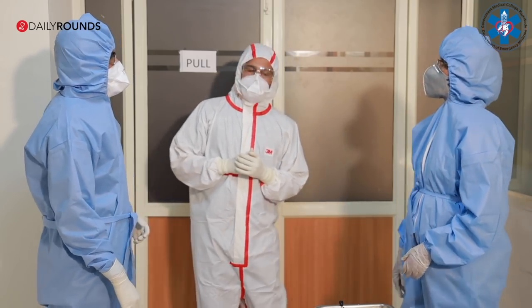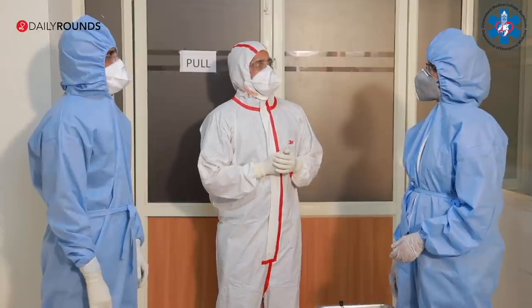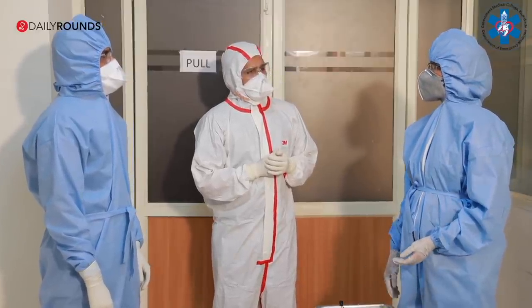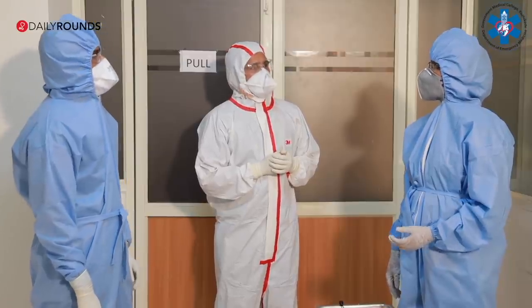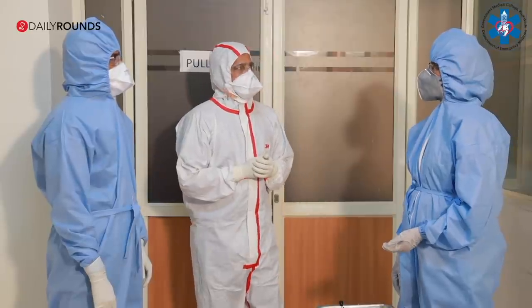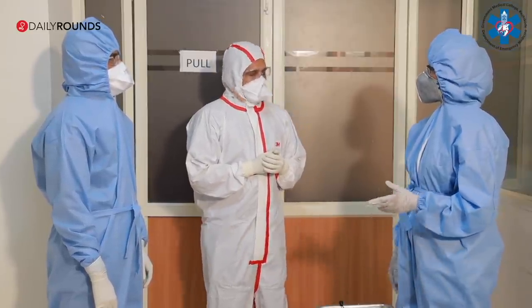Okay. So, we have a patient, 35-year-old male patient. He's a COVID-positive patient with ARDS. And as of now, his hemodynamic status is stable. But he needs airway assistance as well as he needs ICU care. Okay. So, let's move to check our intubation protocol. Yeah, sure.